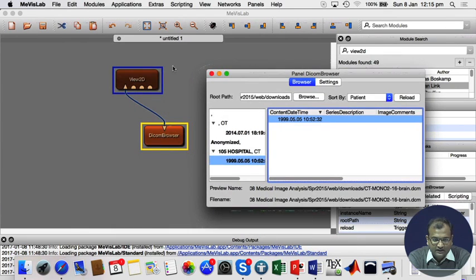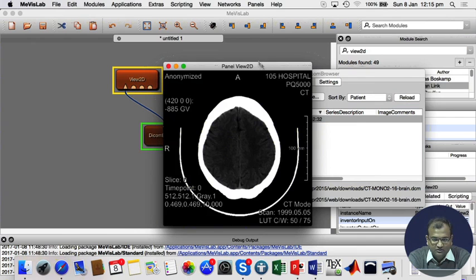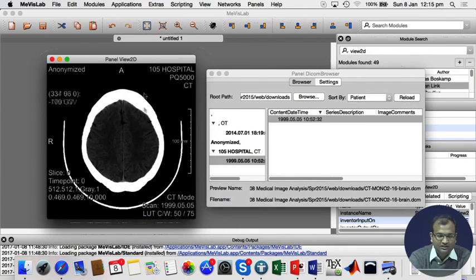and then I need to invoke this viewer over there. When I invoke the viewer, this is what I see. Now this is not a 3D one which I have over here. If you have a 3D, then you will have to invoke a View 3D as well. So I will open up the other one and show you on a View 3D how it looks.